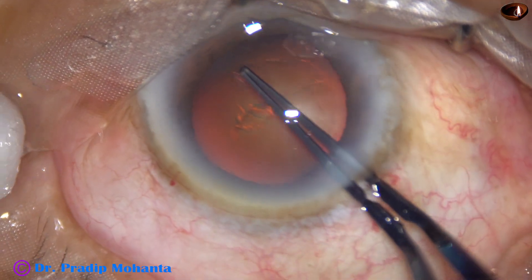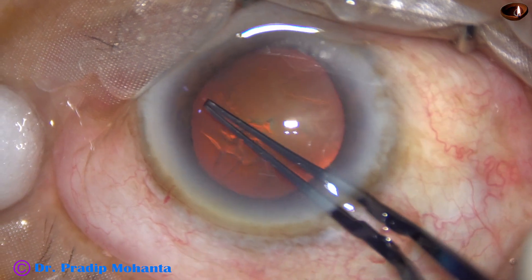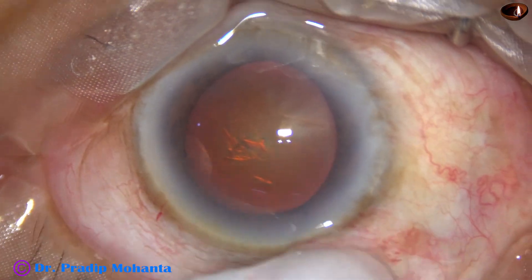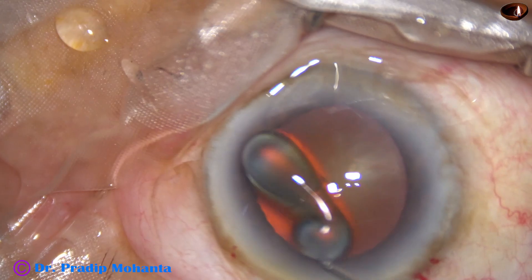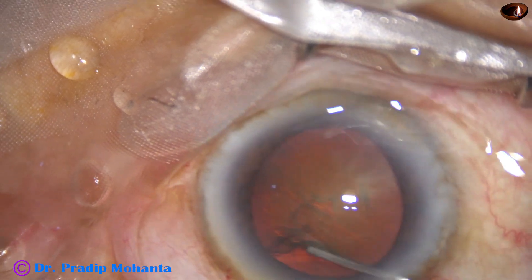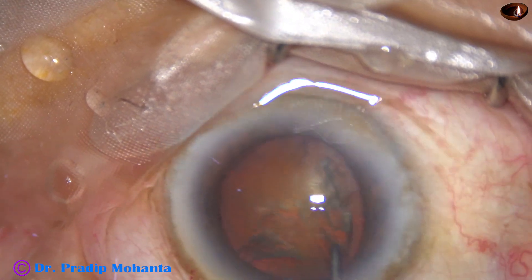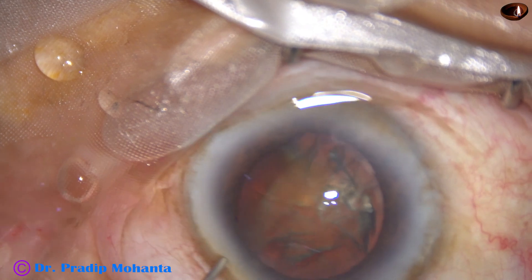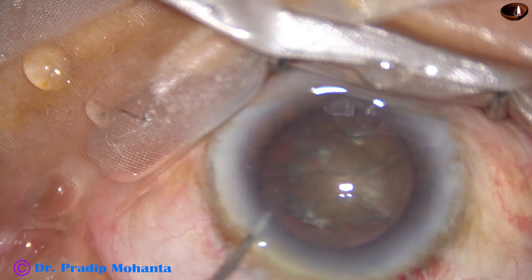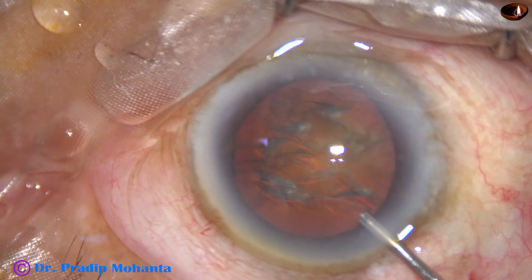In this case the microscope is OMS 800 by Topcon. The capsulorhexis is done. And now hydrodissection. Hydrodissection is done with BSS and a 27 gauge cannula. The nucleus is tapped. Some more mobilization, and we can see that the nucleus is rotating. Some more visco to fill out the anterior chamber.